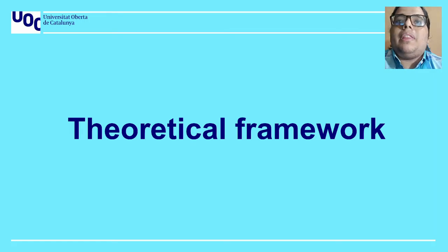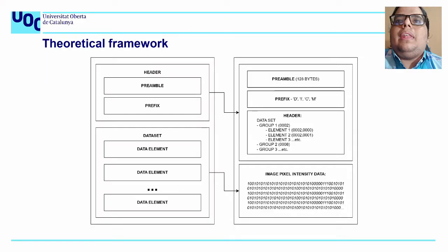Now we have the theoretical framework. In the theoretical framework, here we have an image of how a DICOM image is made, the structure.